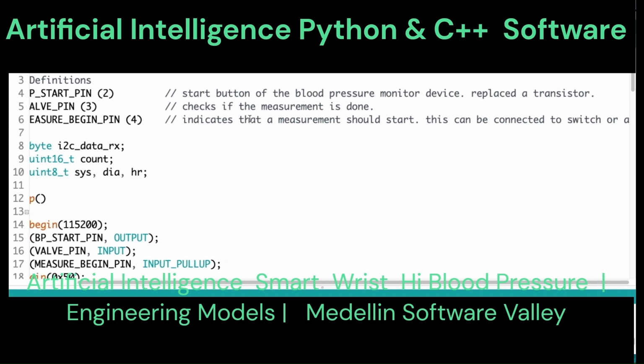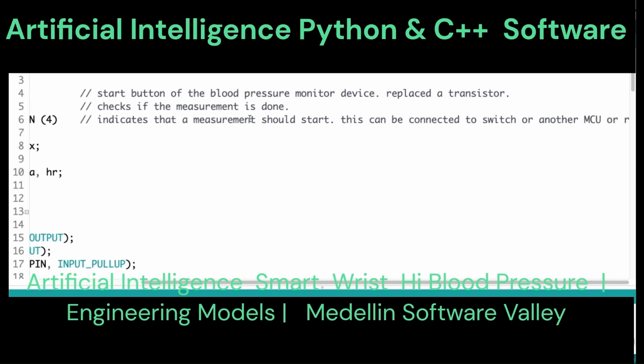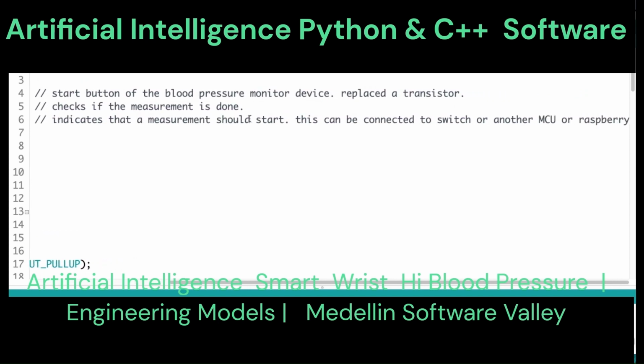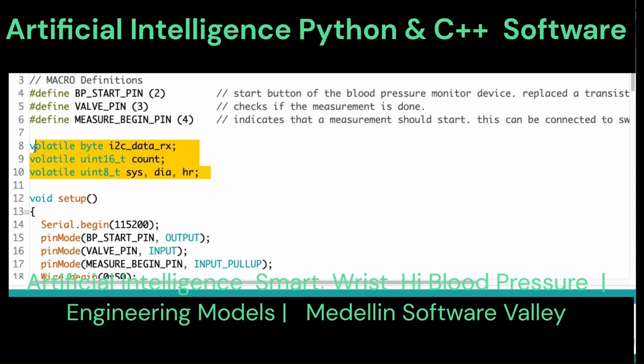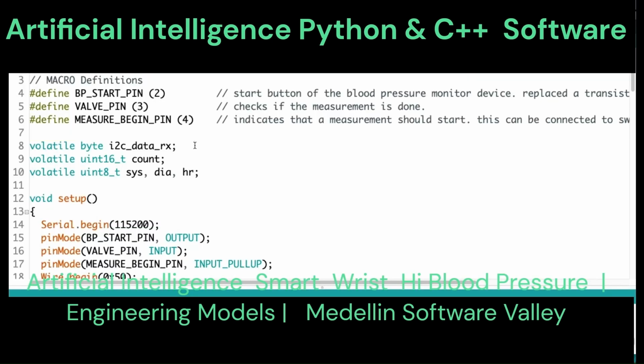The system architecture consists of a hardware system implementation based on a reduced instruction set computing system. The hardware of the tool is made up of the main CPU board that serves as a controller, and it works from a blood pressure sensor device.